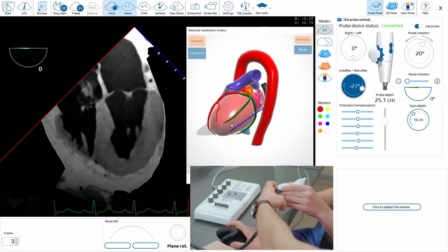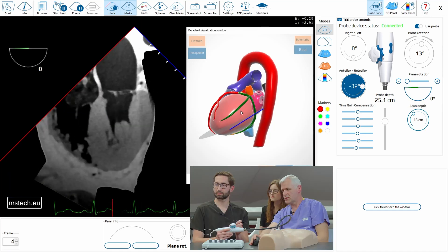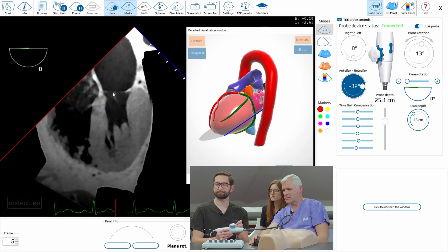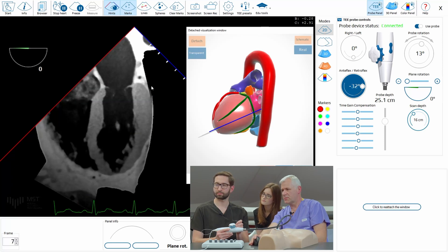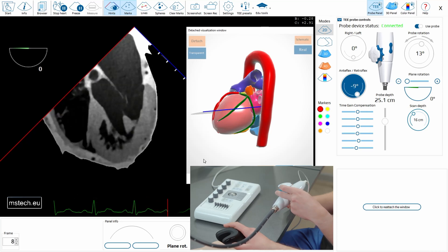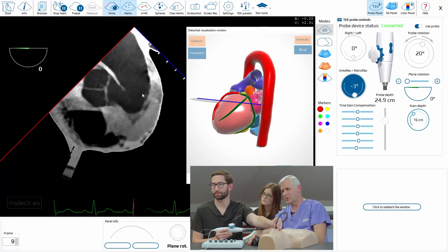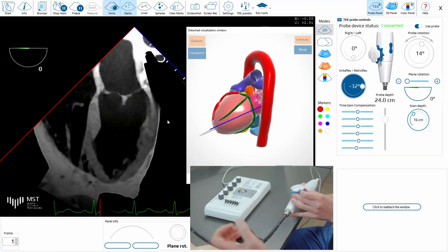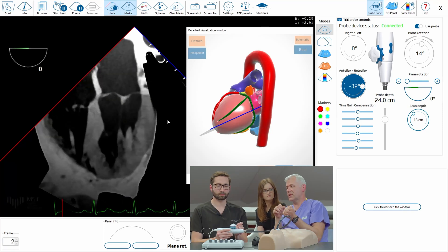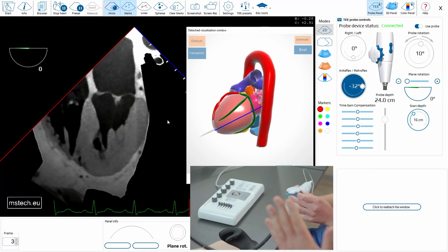Going posterior, we see a very long ventricle, which is good, but the valve is becoming smaller — so perhaps we are too low. We need to pull up a little bit to see the biggest possible mitral annulus. If you release the retroflex you come back to the original position, so you can pull up one or two centimeters and do another retroflexing. You're also allowed to slowly withdraw the probe even if it's retroflexed, a few millimeters, if you don't feel any resistance.